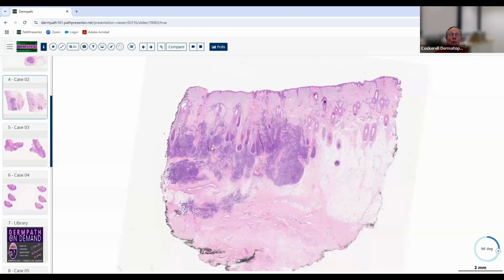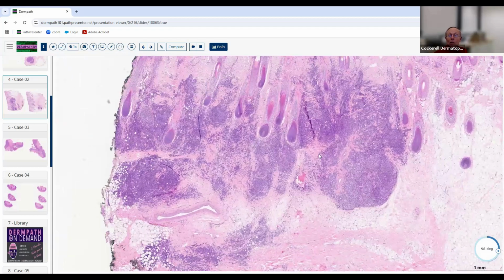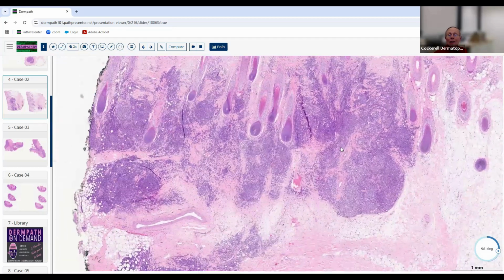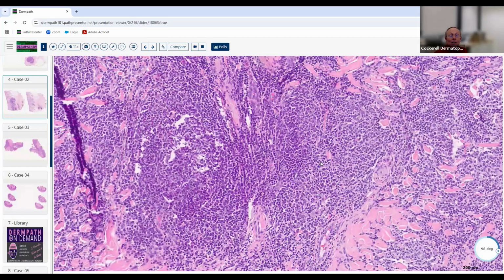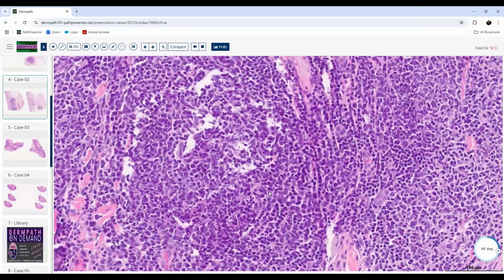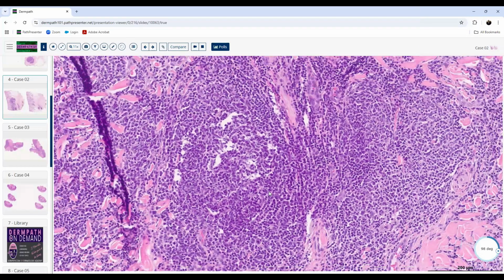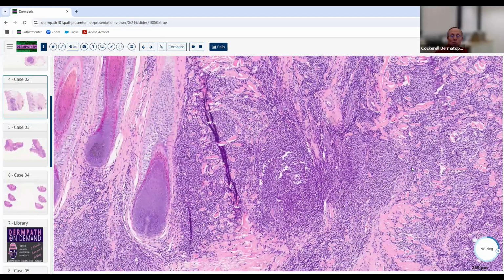And then you also pointed out it was very basophilic. When you see something that's basophilic like this, you jumped immediately to the diagnosis of a lymphoma, but what else is in the differential diagnosis of these kinds of cells here? Oh, I don't think it's this, but it could actually have been a neuroendocrine tumor. Good, good. That's what I wanted you to think of.